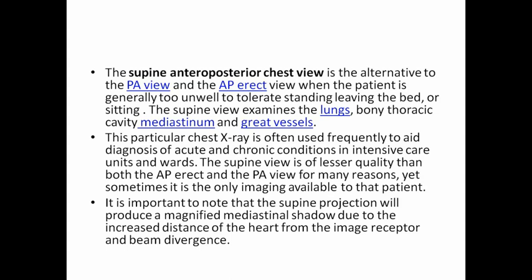Then particularly when we need frequent X-rays in ICU, any isolated ward, it means any portable radiography, at that moment we will take an AP supine. Compared to AP and PA, I added that in a few slides later.